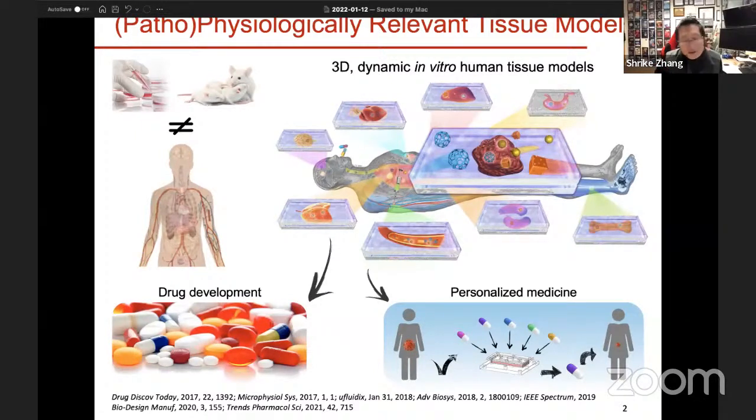And then what's interesting is that you can also start to connect these different organ models together in a way that these organs are connected in human systems, so that you can start to also look at their interactions in vitro, right? So not only organ-organ interactions, but also organ-drug interactions in this multi-organ format.